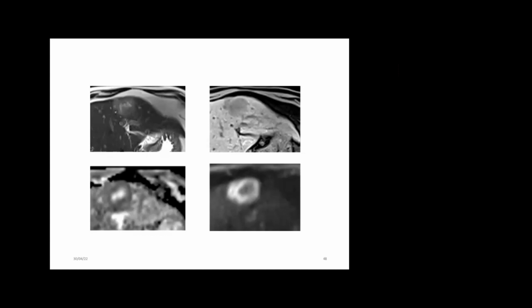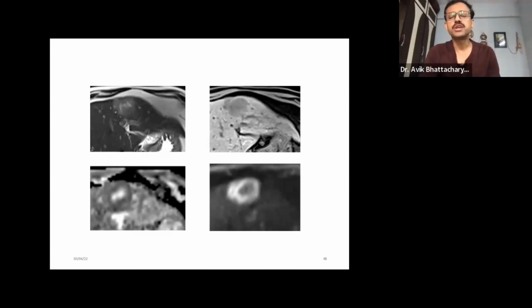One PG asked, what are the indications for doing diffusion weighted imaging? A diffusion sequence is a fabulous sequence. It takes 40 seconds, so it is not time consuming, and it gives us so many important pieces of information that even in brain it is a standard sequence taken in every patient. Even in abdomen also, we take diffusion, it is also a standard sequence.